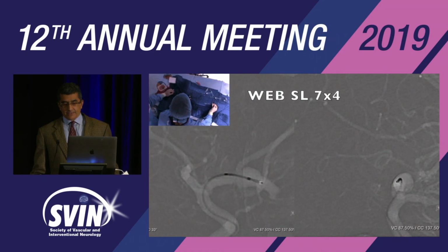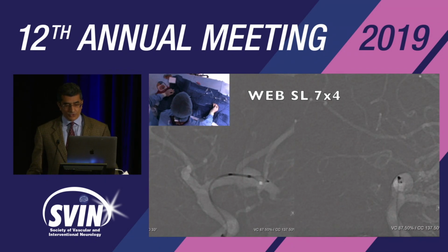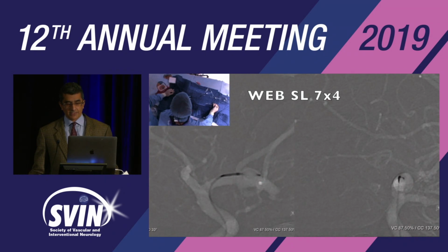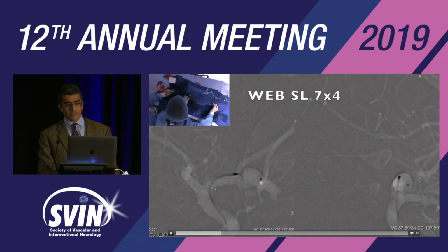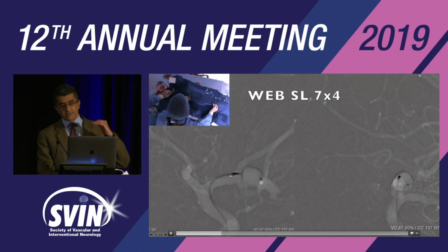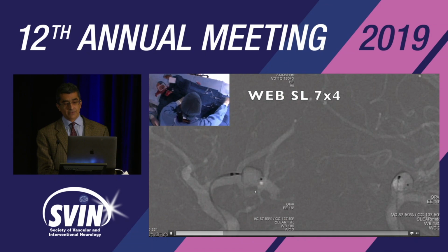And so here the device is barely out. We're proceeding very slowly. It jumps into the pseudoaneurysm, which is okay. We bring it back. You can see how dynamic the motion is going back and forth, and that's why it's important to use the right and the left hand together. The device is deployed. One thing I would point out, the catheter is distorting the anatomy a little bit, so when the device detaches, it will settle down inferiorly, and so we have to keep that in mind.